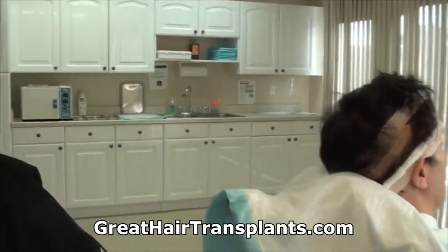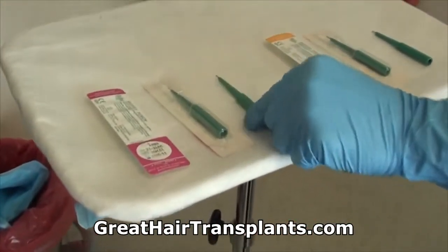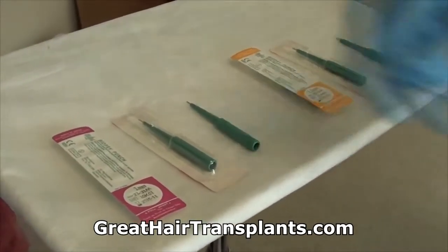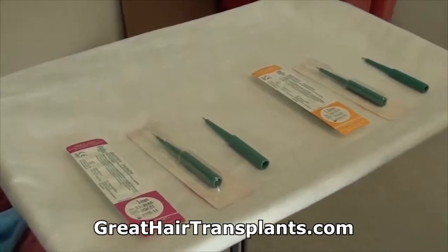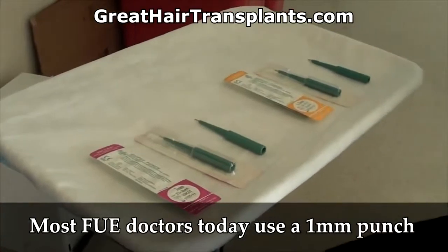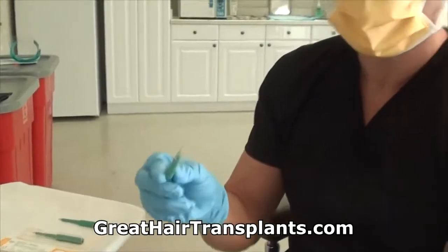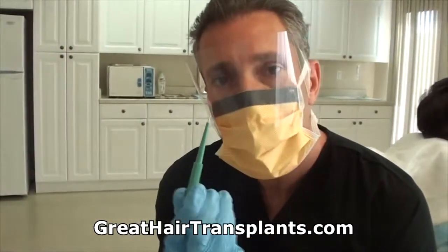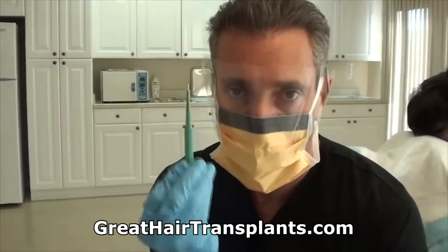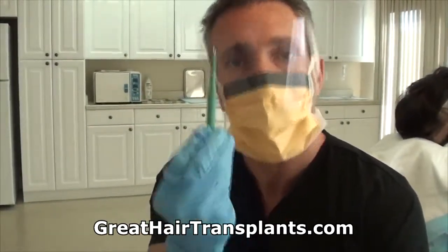Okay, so if you take a look over here, we already kind of showed you what we're going to be using. What the doctors will use today are different size punch instruments. They're biopsy punch instruments that will take out the follicular unit one by one. Most doctors today are using a 1 millimeter punch. A 1 millimeter punch will get out that tiny little follicular unit. Now, imagine trying to take this little instrument and punch out a hair. Okay? That's what you're asking your doctor who does a follicular unit extraction to do. Blindly pull out a hair one by one so you won't have a scar.